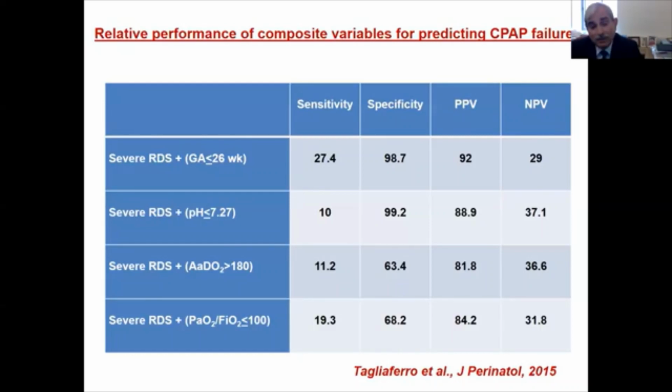Another question, are there any studies comparing, you're talking that now the bubble CPAP is working almost like that of HFOV? High frequency. Sorry? I've heard about it, people talking about it. It is where HFOV with the mask is an effective way of removing CO2. That's been shown, but whether it means anything from the short-term BPD, I'm still waiting for the data. So at present there is nothing supporting it. Now, some of the new ventilators are coming with nasal HFOV facility. Any studies comparing the CPAP with nasal HFOV? No, not that I'm aware of.